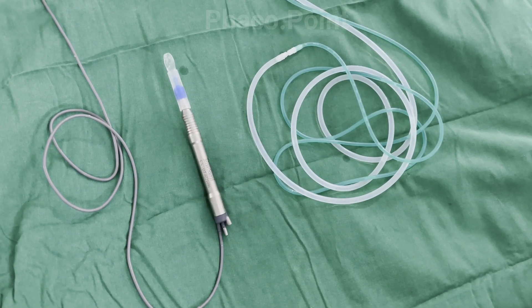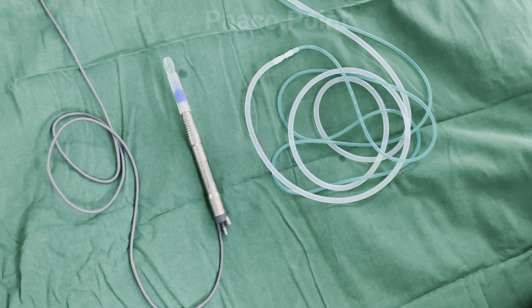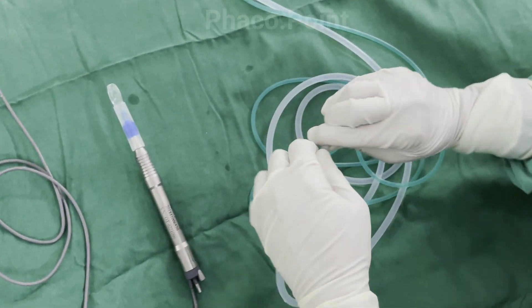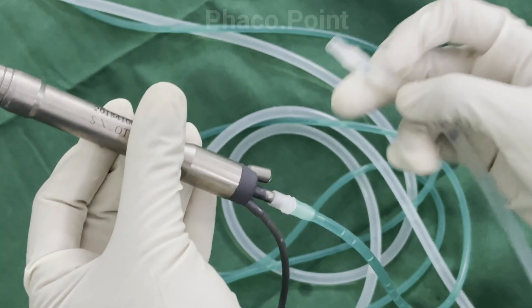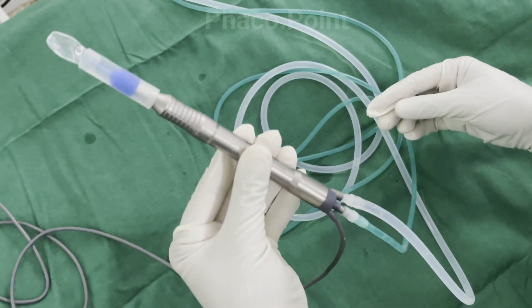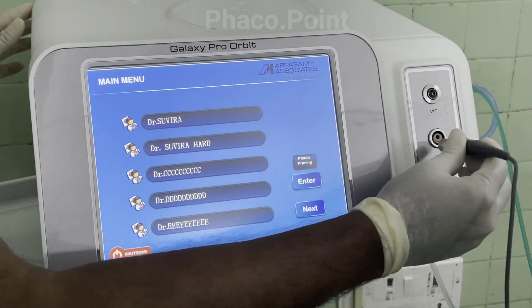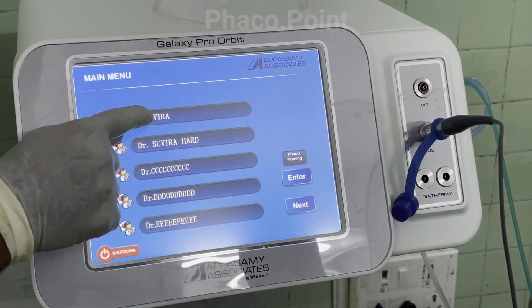We now move to the other end of the tubing. The white tubing with the wider bore is the irrigation tubing and the green tubing with the narrower bore is the aspiration tubing. The assistant dissociates the irrigation and aspiration tubings and connects them to the corresponding points on the handpiece — irrigation to the right socket and aspiration to the middle socket — confirming they are firmly attached. The connector of the FACO handpiece is then connected to the correct socket, after which the FACO machine is primed.